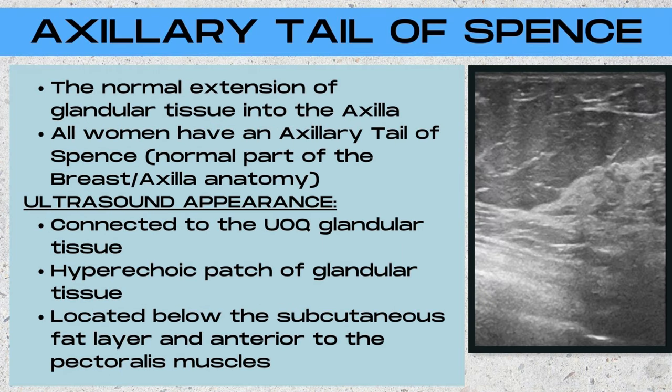The axillary tail of Spence is the normal extension of glandular tissue into the axilla. All women have an axillary tail of Spence — this is a normal part of the breast and axilla anatomy. The ultrasound appearance is going to be a hyperechoic patch of glandular tissue that is contiguous or connected to the upper outer quadrant glandular tissue. You'll know it's the axillary tail of Spence because this tissue just continues on up into the lower axillary region, and also by its depth on the ultrasound image.